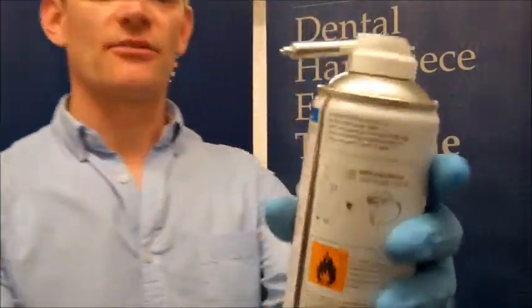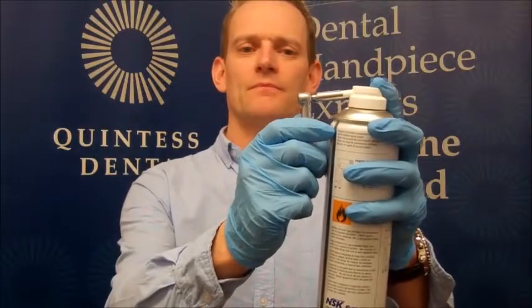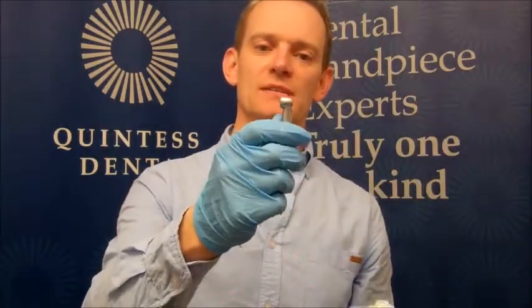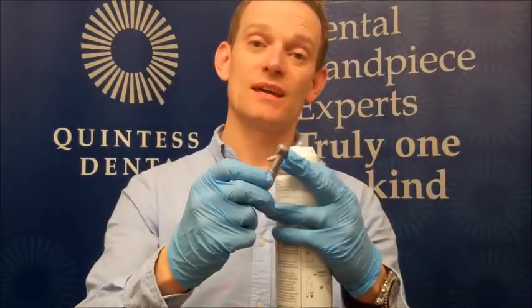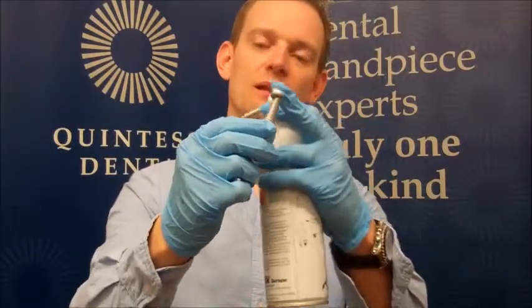Another good tip is to take a fine pointed nozzle on the can. This will apply oil into the chuck. Give that one or two sprays, and that will oil the chucking mechanism within the spindle of the cartridge.